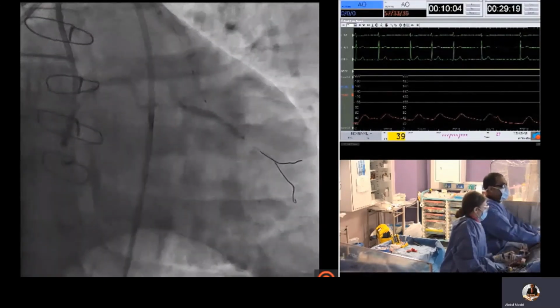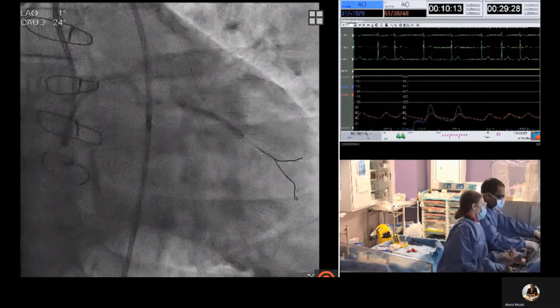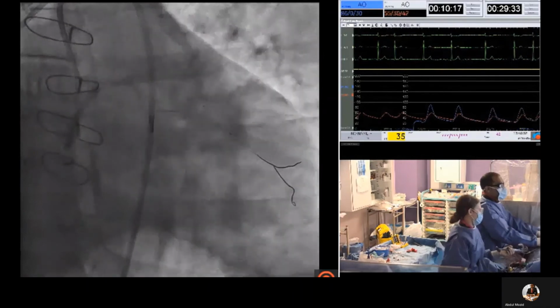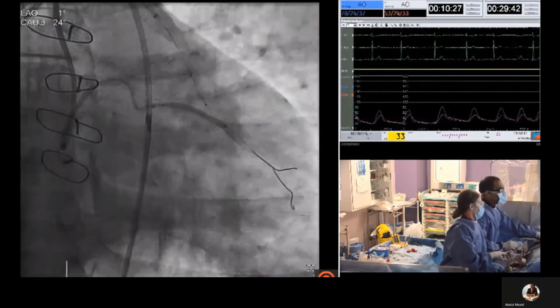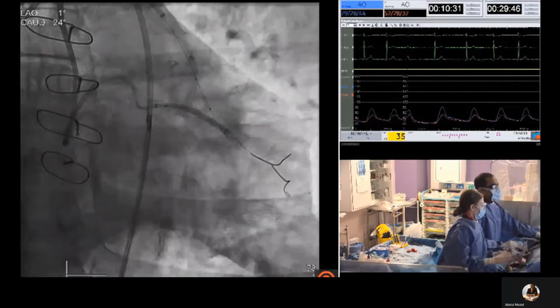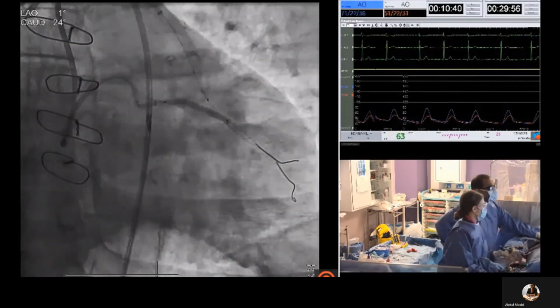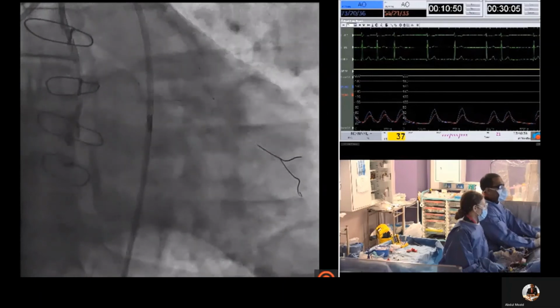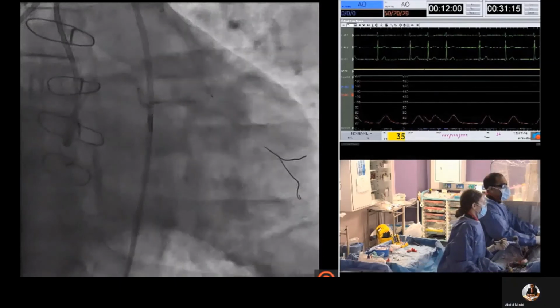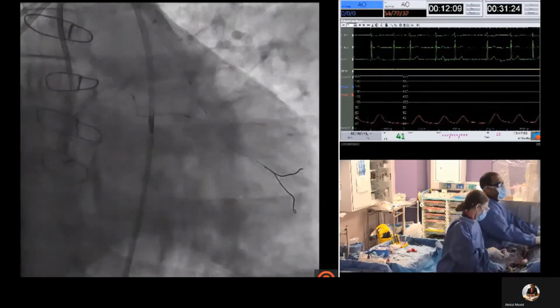This is the first stent delivered through the occlusion into the obtuse marginal. This was a 2.75 by 28 mm stent. The stent was post-dilated to high pressure with good expansion of the balloon. And this is a 3.0 by 33 millimeter stent being delivered and deployed from the lesion into the proximal circumflex.